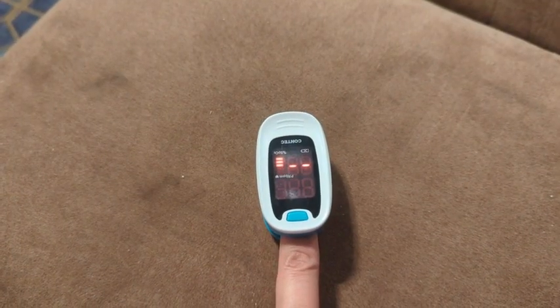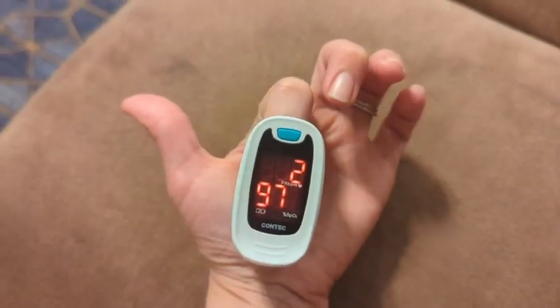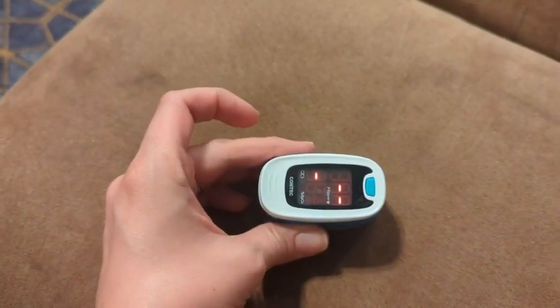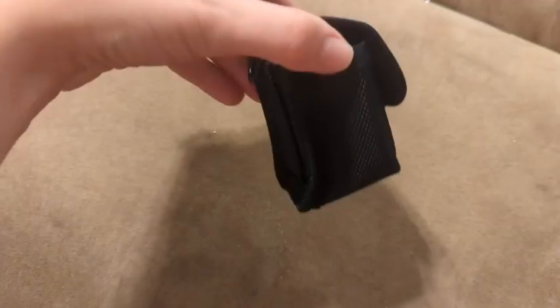This has been a great solution — super simple to use. All you do is put your finger in and it tells you your oxygen levels and your heart rate. Now I have some peace of mind when my kids aren't feeling good; I don't have to rush right to the doctor. It comes with a nice little carrying bag so you can't misplace it. I highly recommend it, but that's just my point of view.